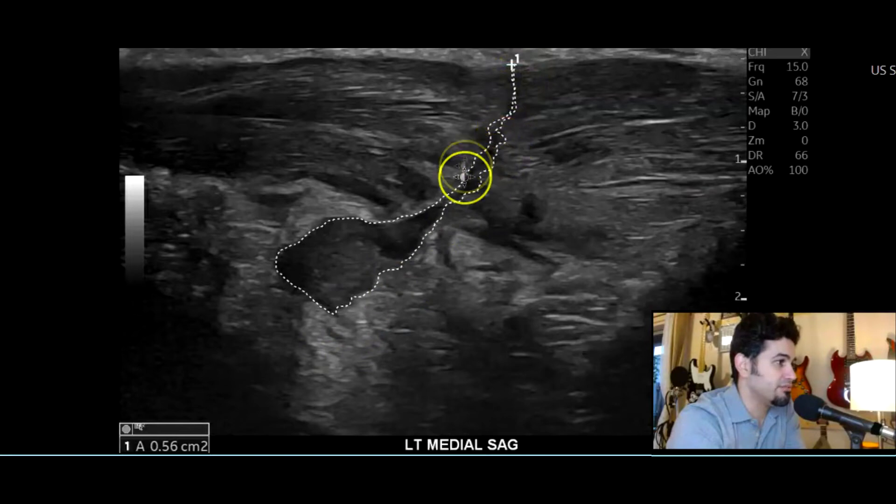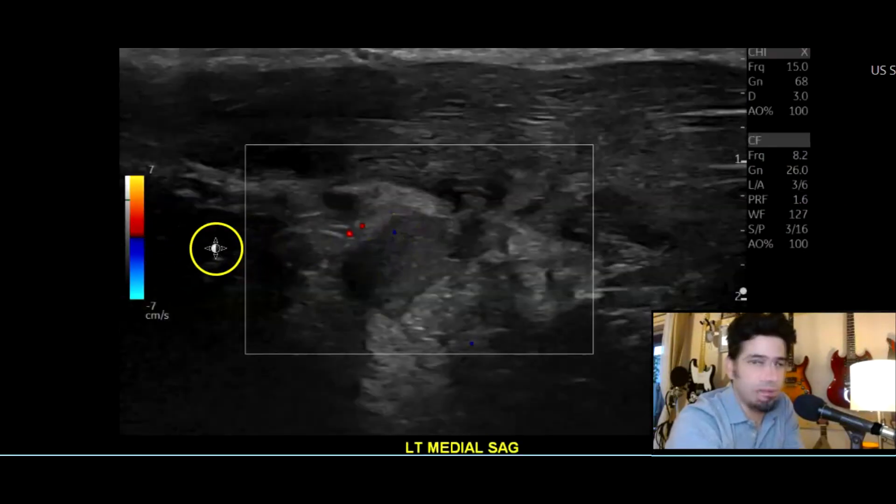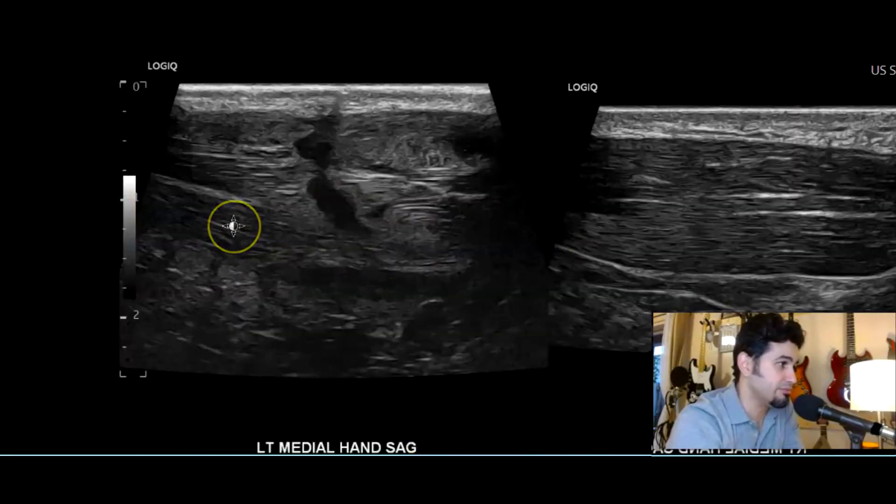You can see all this is the laceration, and here's a little hematoma. I like to trace it to show the outline for the radiologist, so you can see where the tract is from the wound, and then the fluid collection, which is most likely a hematoma — blood collection. Every time you see a collection, put color Doppler on it to make sure it's not a pseudo-aneurysm or other vascular structure.